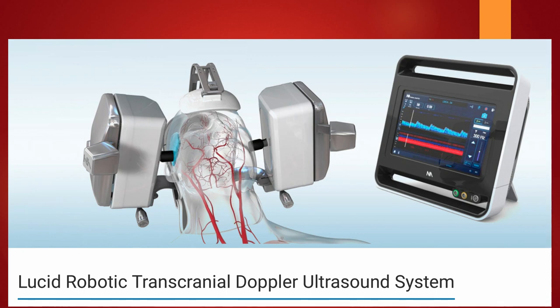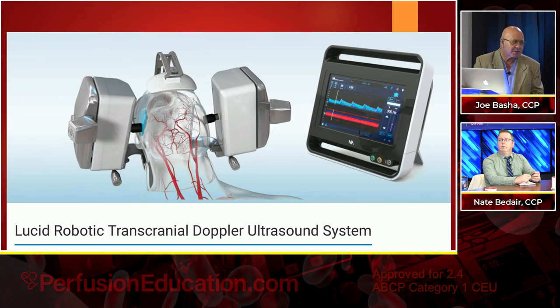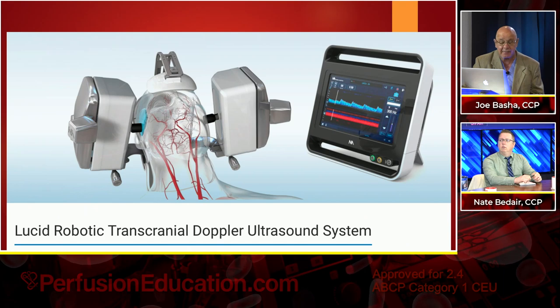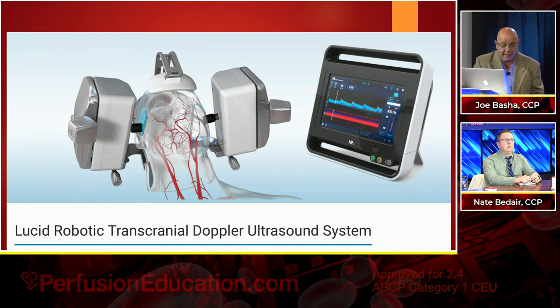But this is a robotic and automated device, which is a lot easier than the old style TCDs. However, with that said, you notice you're occupying a lot of real estate. That's going to be in the way of anesthesia. Absolutely. For this to be adopted into routine cardiac surgery, it's going to require being a whole lot smaller and a whole lot easier to use. Right away, I think that's the issue that I have with it. But I think it's brilliant, and I think it needs to be done.